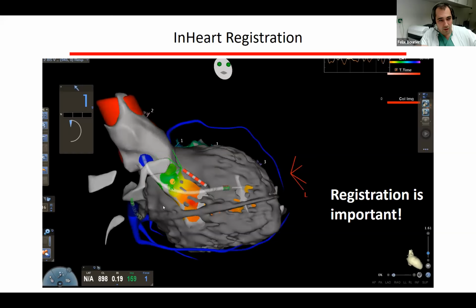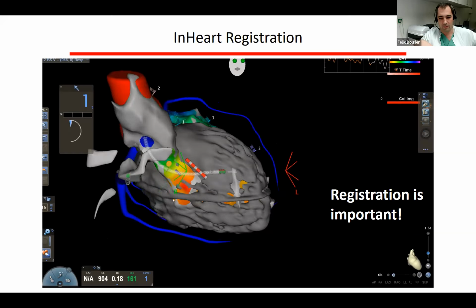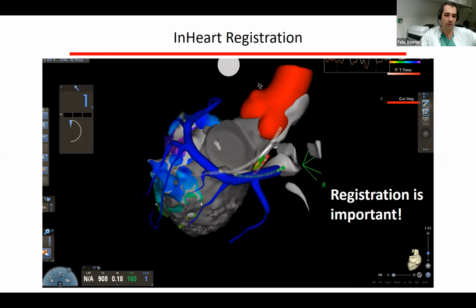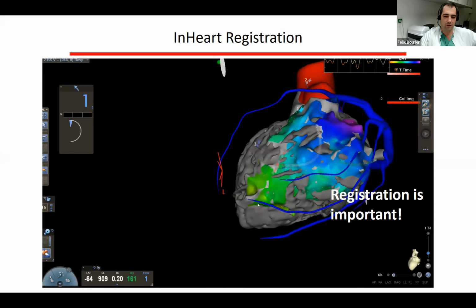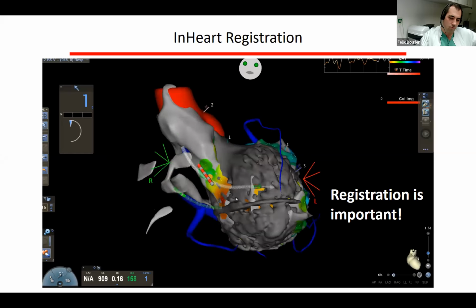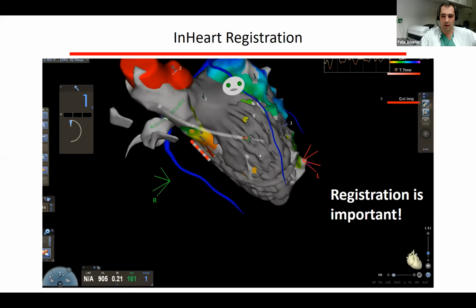If you consider landmarks far away from the heart, let's say the spine, some bones, or the ICD pacemaker itself, they are always affected by, let's say, respiration and ECG gating. I think taking landmarks close to the heart will give you a great level of accuracy.